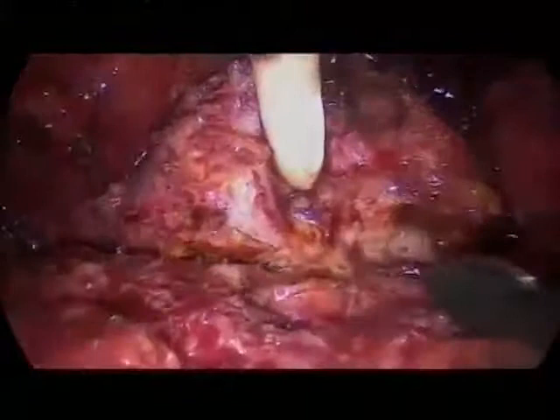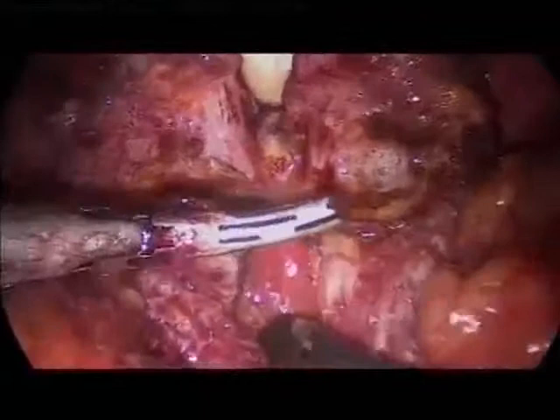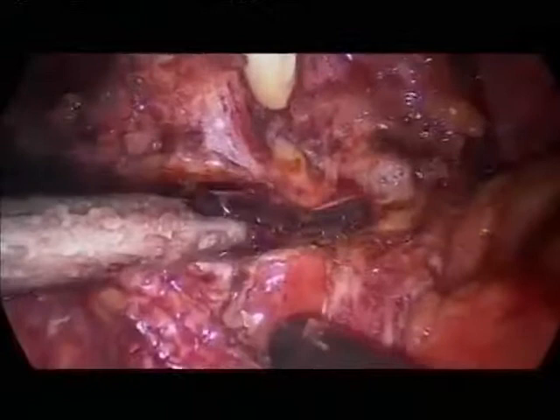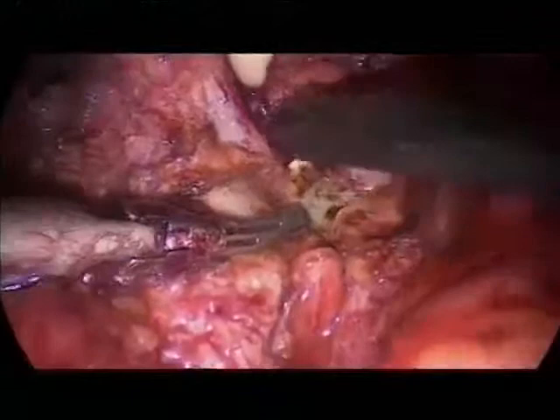So I will show it later to you, and then probably it's easier or better to see. This is the bladder neck, you see it, and we go straight forward through the bladder neck at a 6 o'clock position. We don't mobilize laterally too much because we come very close to the nerves. So we go just here through the bladder neck. And the next structure that we will see are the vas deferens from the left and the right side.